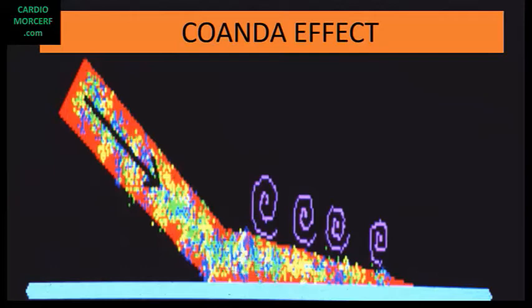Now comes another universal physical law, the conservation of energy, that says that within a closed system, the total form of energy must be conserved. In other words, if the velocity or kinetic energy of the upper free layer decreases, some other form of energy must increase. Then the pressure energy increases only in the free upper layer, pressing the lower layer against the wall where it cannot escape. That's the Coanda effect.